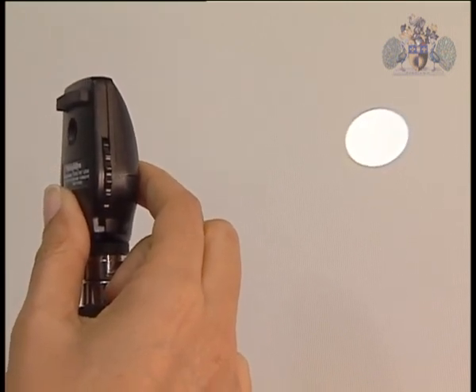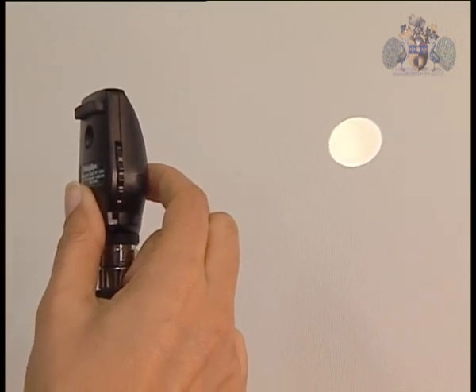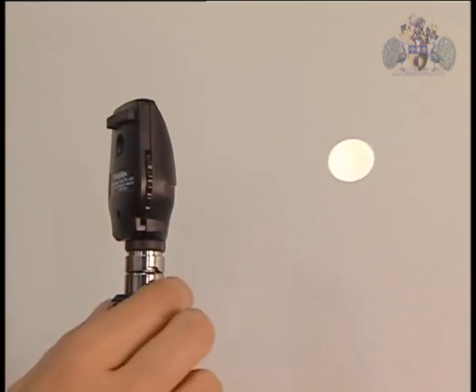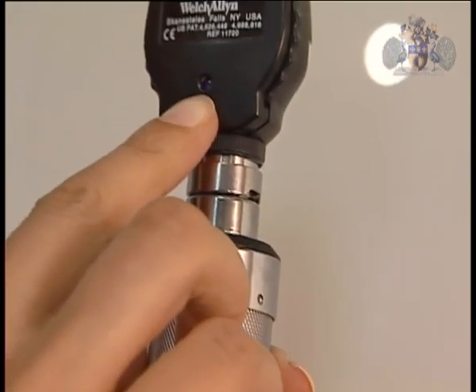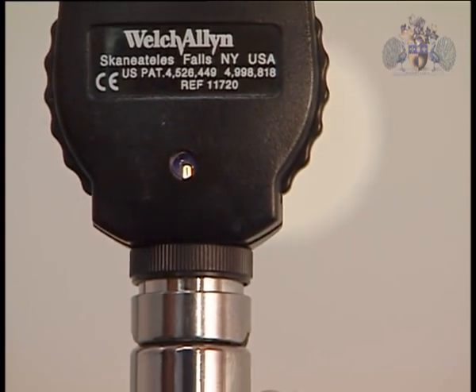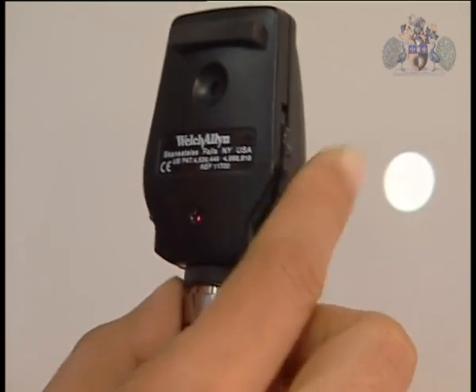When you've used the bright setting to check the red reflex, you may want to switch to the dim setting to make it more comfortable for the patient. When you turn the ophthalmoscope on, you will see the little window lighting up with a number. The dials on the side will adjust the number you can see.